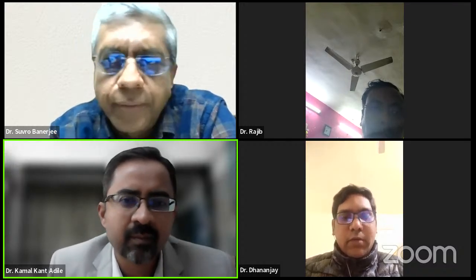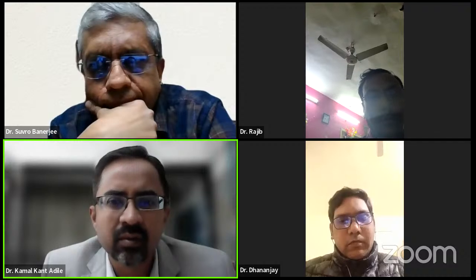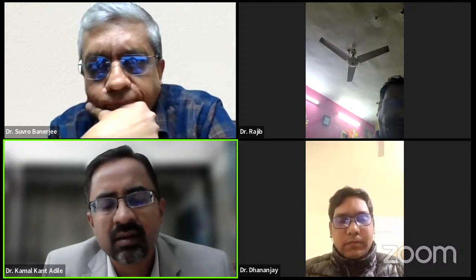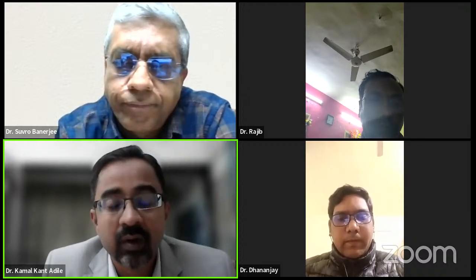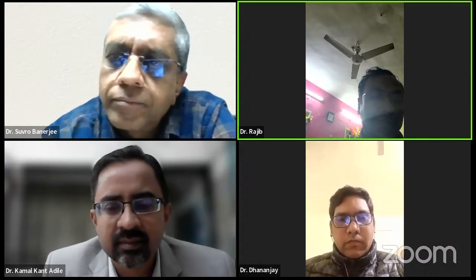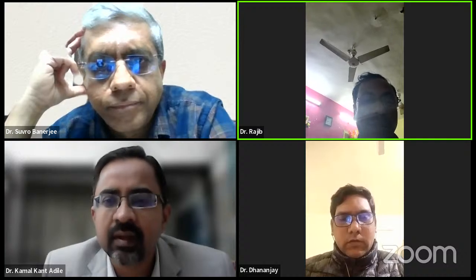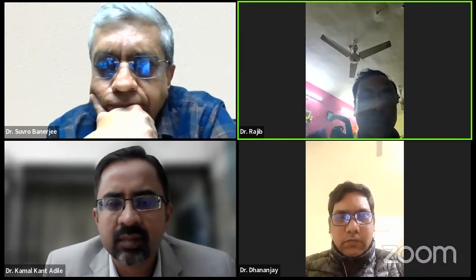Even in TIMI 2, sir? No, TIMI 2 flow usually gets improved over time. You can deploy a stent, but if there is no flow at all, or just TIMI 1 flow, just leave the lesion. That is what I practice. In some cases, even if you give everything, even adenosine, even GP 2b3a, whatever you give, after that also you will not get distal flow, due to heavy thrombus. That is true. And basically, if the patient's artery is aneurysmally dilated, like ectatic vessels, then it is too tough to do procedures.